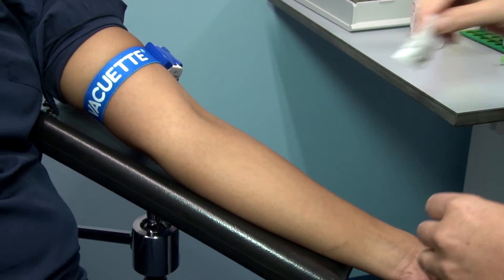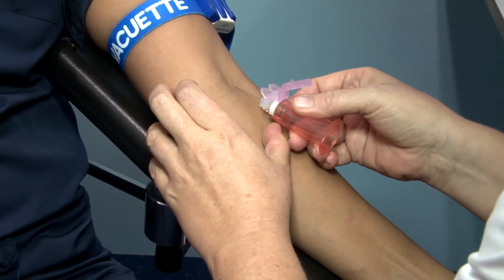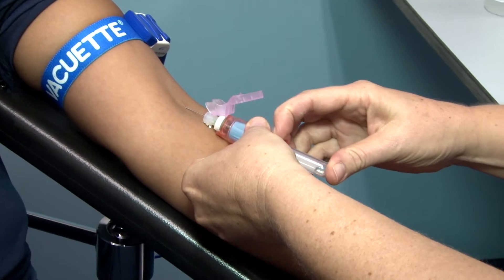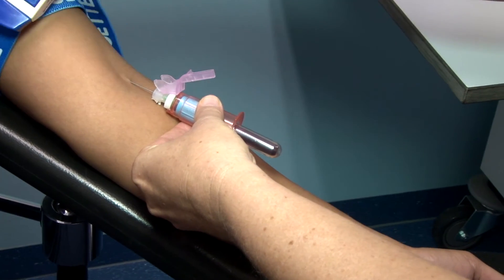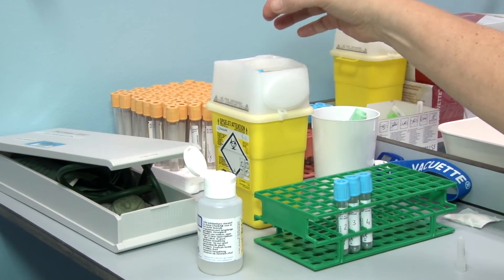The skin is disinfected, the vein is located, and the needle is going to be inserted. The first tube of blood will be collected, the tourniquet is released, and the first tube of blood will be discarded.